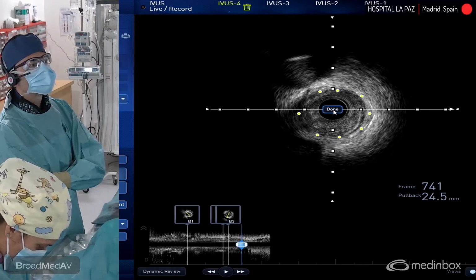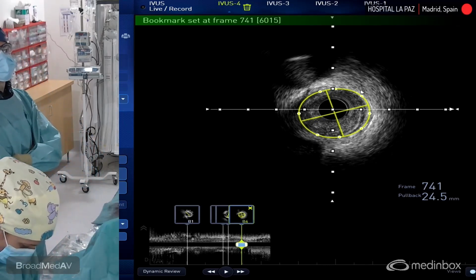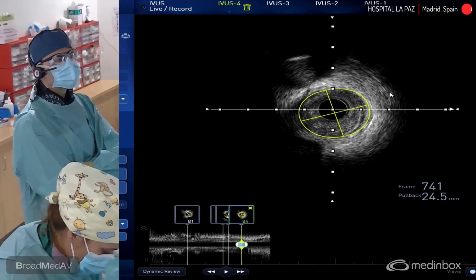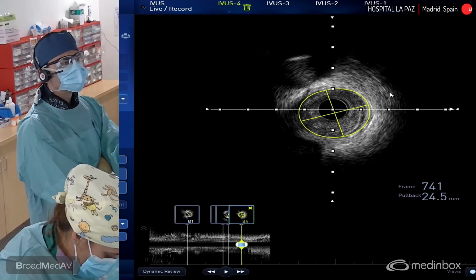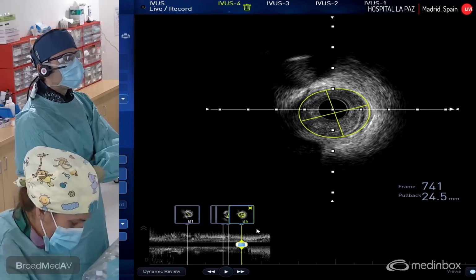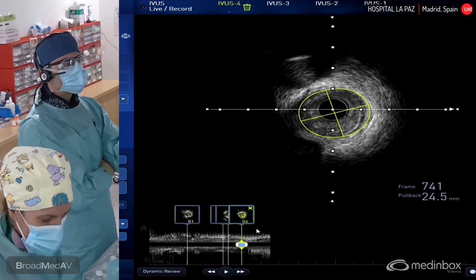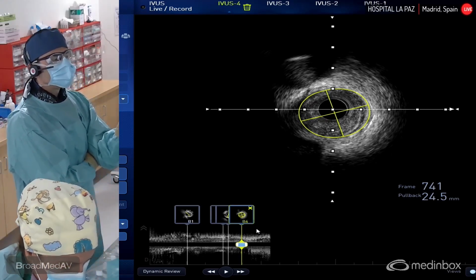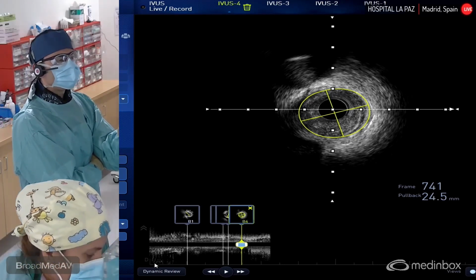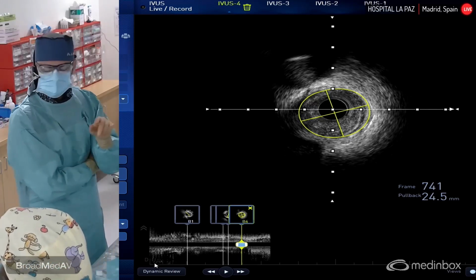We have administered nitroglycerin, but after crossing the wire, we have again a vasospasm. It's similar to the LAD. We have a clear disease there, but a 4 point something is probably less than 4.6. It's a more diseased vessel just distal to this frame, but I think it is more elegant, smart, and more beneficial for the patient to treat only the focal lesion at the mid part and leave the ostial part, not treating the left main, because probably there is no need now.